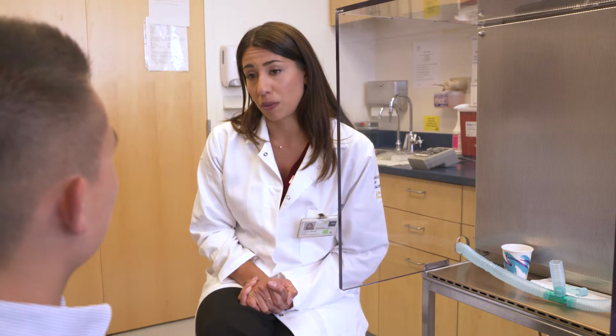Okay, Xavier, the procedure we're going to be doing now is called a sputum induction. It's a timed procedure that involves your active participation, and the goal is to collect a sample of sputum or phlegm from deep in your airways. You'll be doing this procedure inside of the hood. The hood can be a little loud and the screen can be a little dizzying, so you may choose to look away or close your eyes during the procedure.